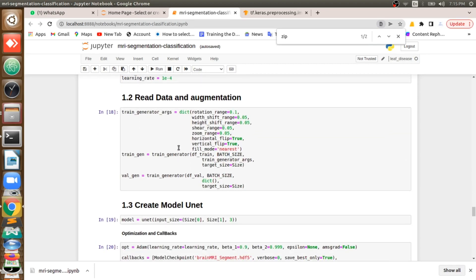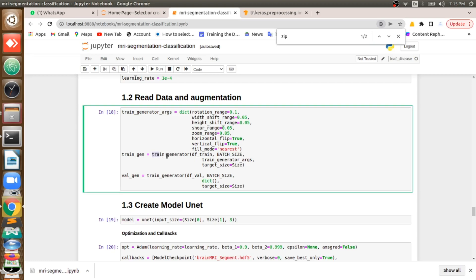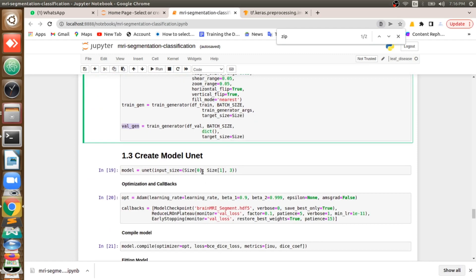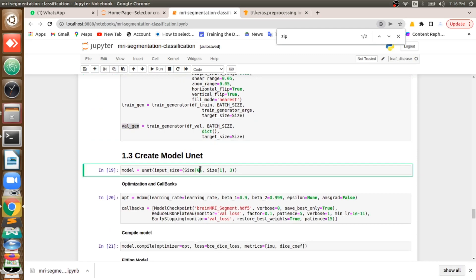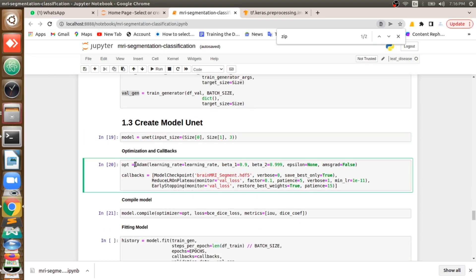Our next process is building the model. First, whatever data we have, we need to reshape it into a form that can be used to train our deep learning model. We apply all the settings — batch size and everything — and train_gen and validation_gen are created, meaning training data and validation data are now ready. We call the U-Net model we created above, and you can see we are using the Adam optimizer. We also use a callback to save model checkpoints as .h5 files so we can load the model next time instead of training again.